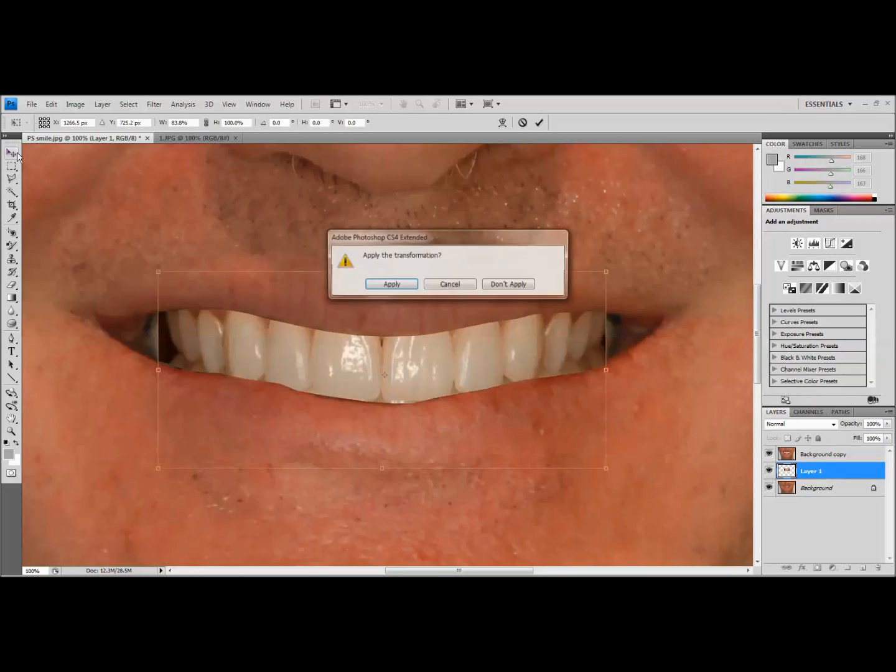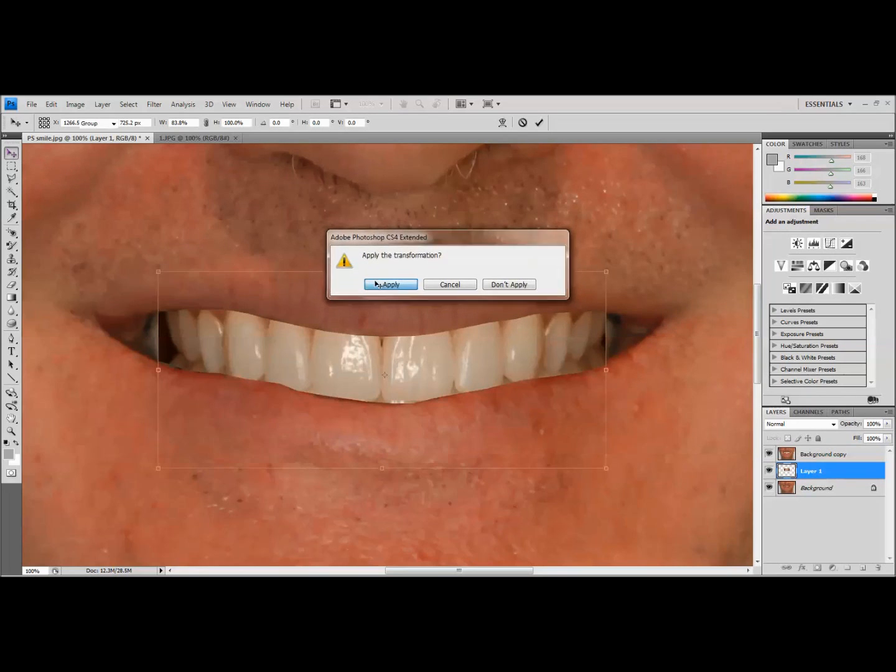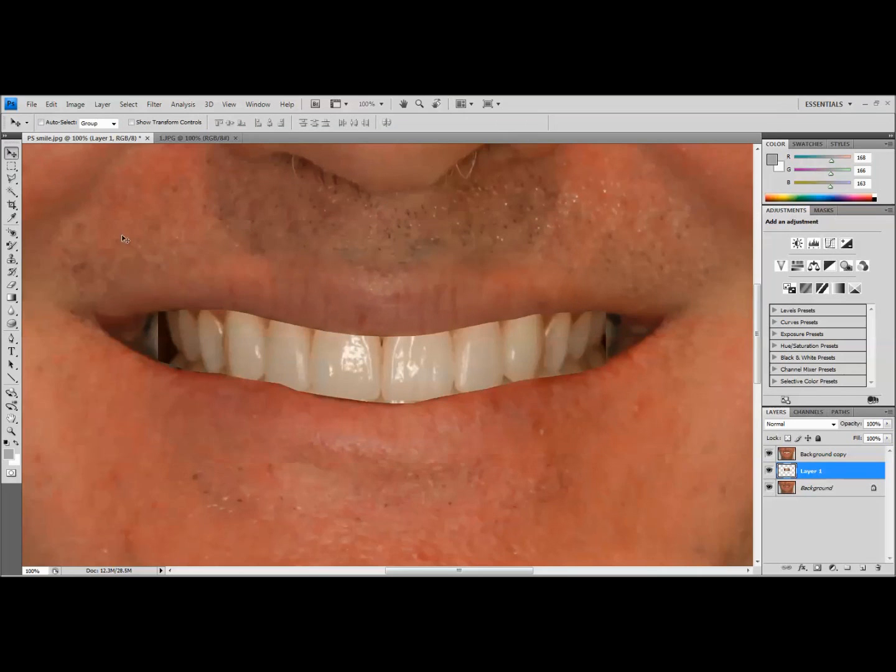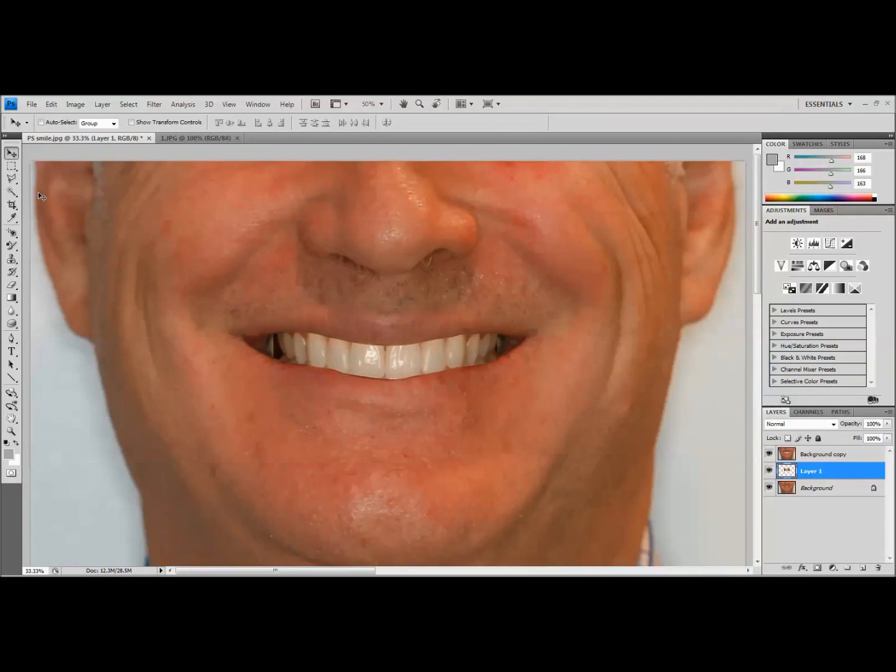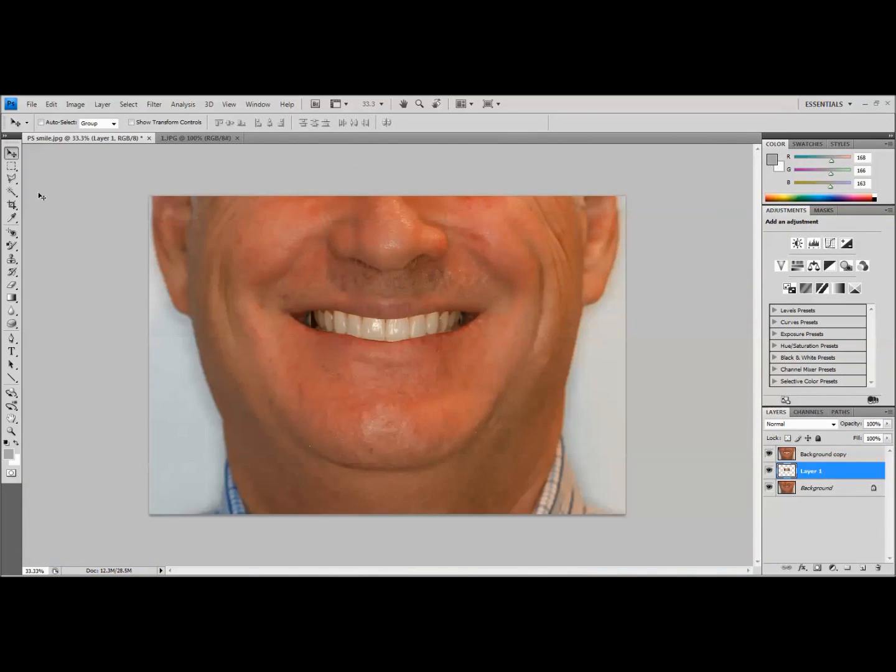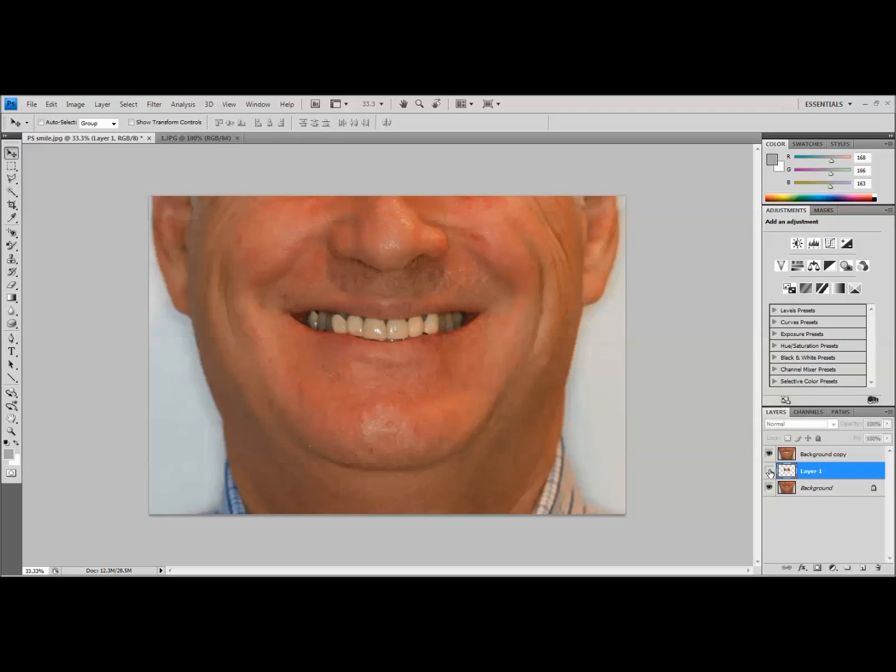And so that looks good. So let's turn our opacity back up to 100% and what you'll be able to see, and you will have to apply the free transform that you just did. What we'll be able to see now is our patient with a simulated smile in the mouth. Now it's not perfect and I'll show you a few tweaks that we can make to it, but if I just turn the layer off, now we can toggle back and forth between what you can see. What we can see was his original smile versus our simulation.